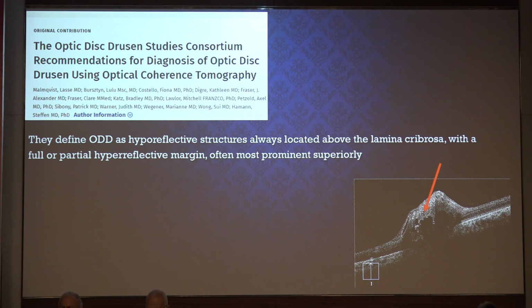Not every pseudopapilledema is drusen, but there are certain pseudopapilledema with drusen, which the Optic Disc Drusen Studies Consortium has defined as hyporeflective core with crenated hyperreflective margins.